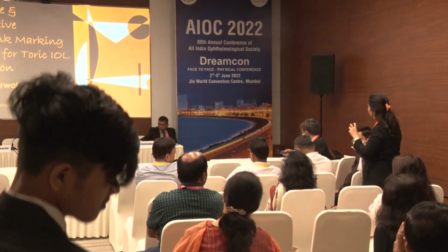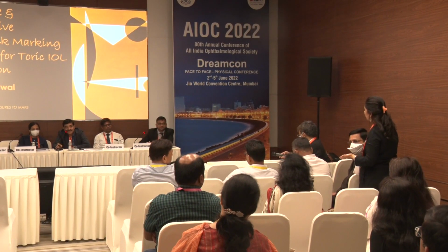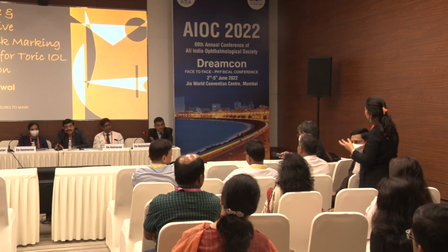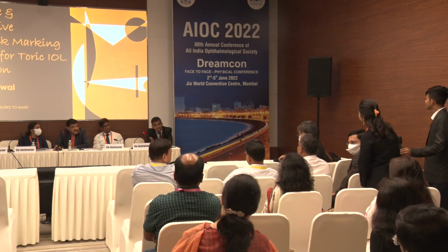Thank you. If I can just add something, that's what I've started doing: look at the quality of whatever scan you are doing. Everybody has an optical biometer. Just looking at the mires or even the reflective points, if they are good, then you know you've got a good reading. You may not have more than two machines, but looking at this raw data helps.